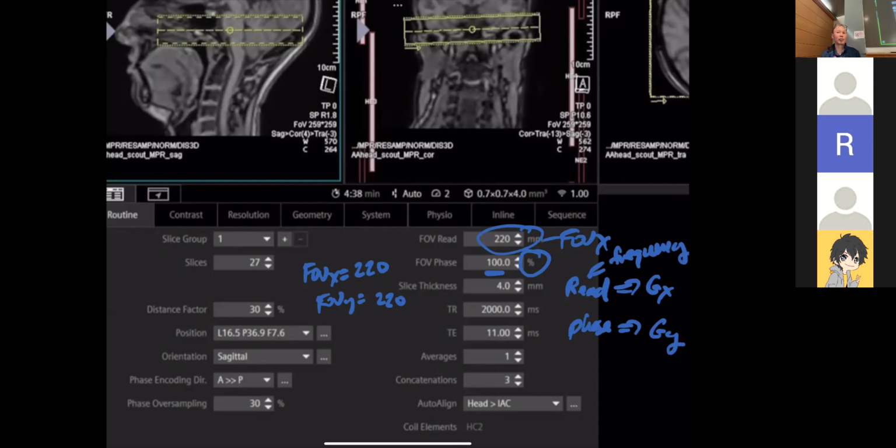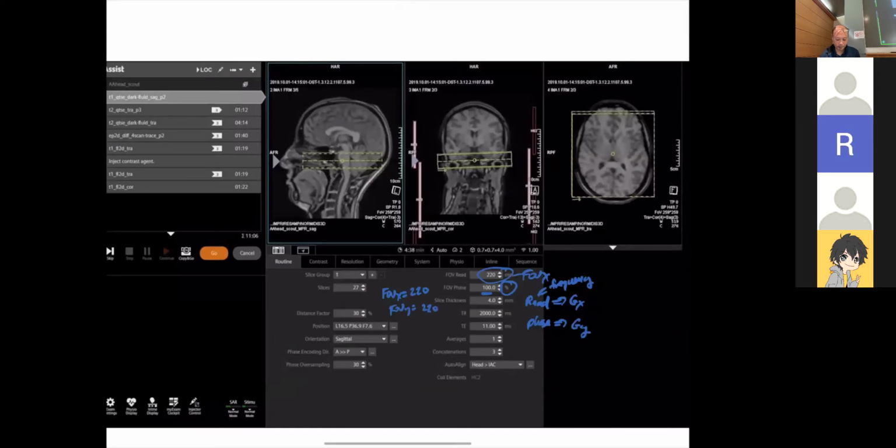So we have to introduce that notation. So when you read things, so for example, when you do your projects, you'll see that, okay, this is readout, this is phase. And so that's basically logical X, logical Y. And then if you do 3D, then there would be Z as well. All right. So those are good questions. Any other thing before we, okay.